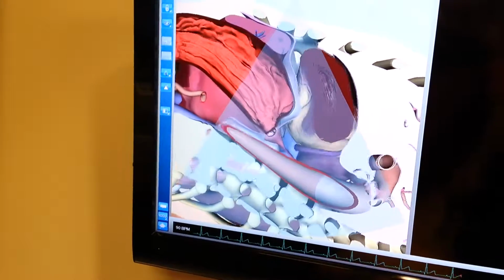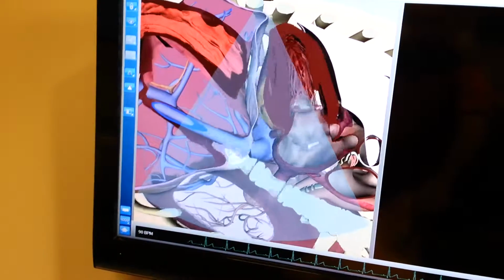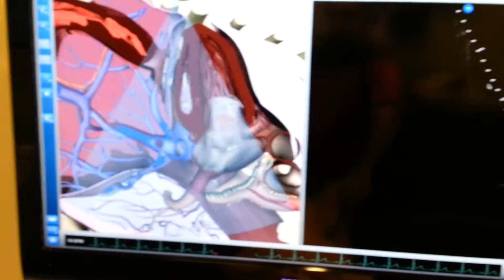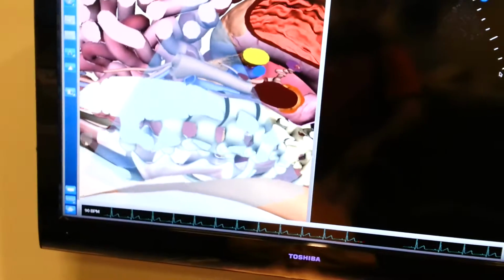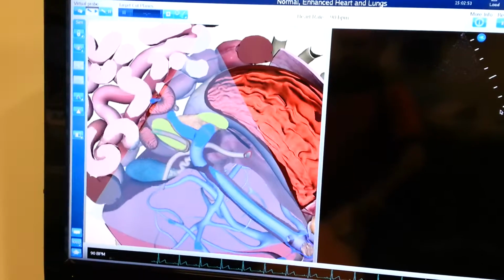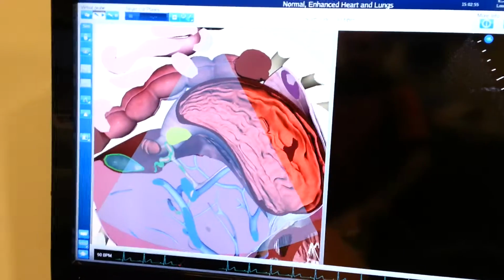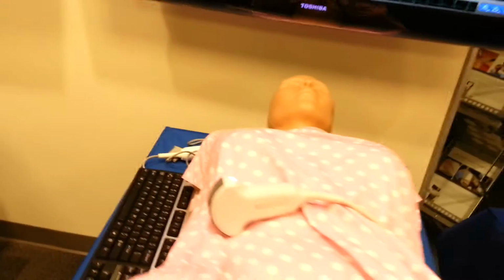And based on this one physical model, we can represent different patients. So we can say this is a 21-year-old male who was just in a car accident. We can also say this is an 85-year-old smoker for 50 years who has heart disease, who's had one lung replaced or removed. We can set the patient up, present it to the students, explain what's happened or not explain, because in real life they come through the emergency door, you don't know what you're going to see.